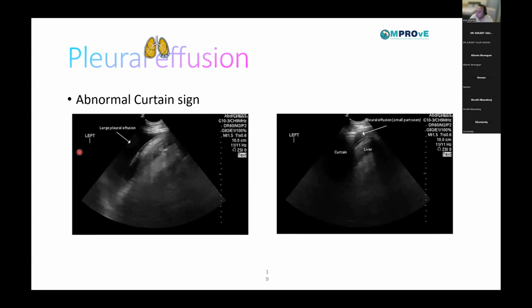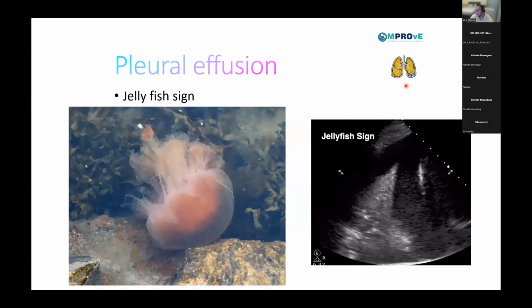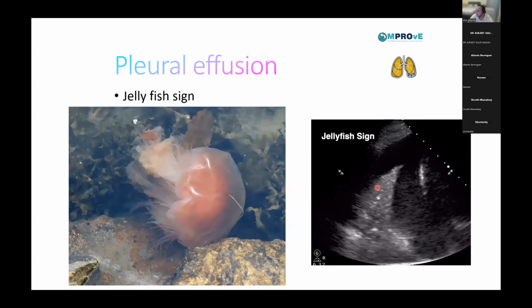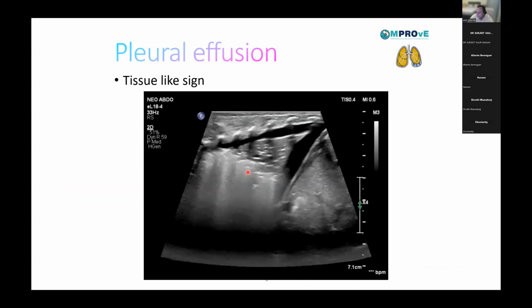But when you have a pleural effusion, it separates the visceral and parietal pleura, and that means the whole of the diaphragm is easily visible. The benefit of an abnormal curtain sign is fairly obvious here, but with very small effusions, they can be picked up as small sickle-shaped areas right at the bottom. This is another very small abnormal curtain sign, because you can see the pleura right up to the lateral margin of the diaphragm. This is classically what the jellyfish sign is described as, lung that's floating in free fluid. The parietal pleura is not very well visualized here, but this is collapsed lung, and you've got static air bronchograms within that appear and disappear.